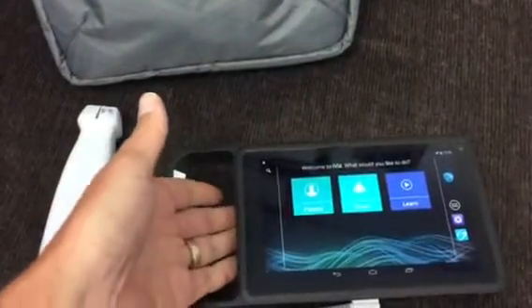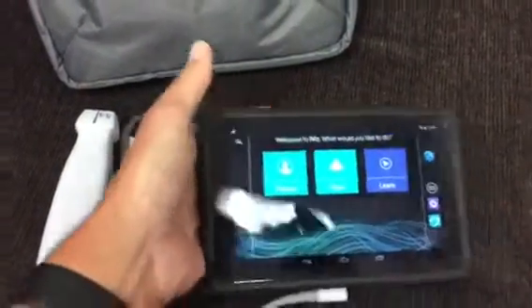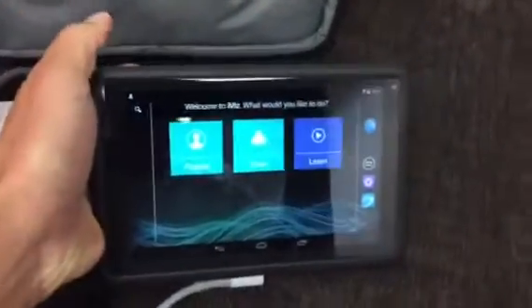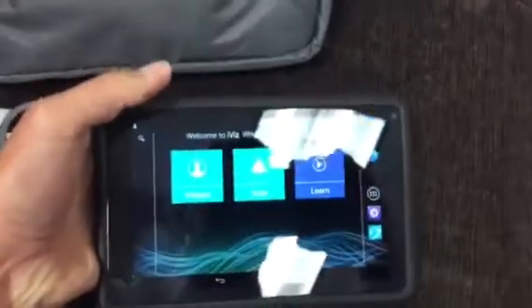The machine is set up so that your non-scanning hand will go in the machine like this. On the back here there is a battery, and there are spare batteries in case you're scanning for a prolonged period of time. Spare batteries are kept with the machine in the CCOT office.